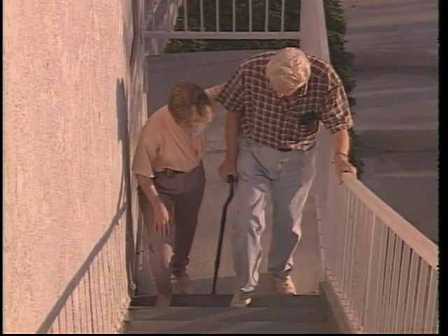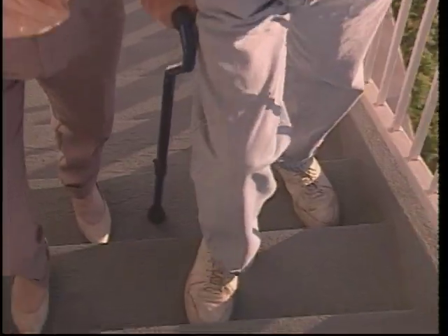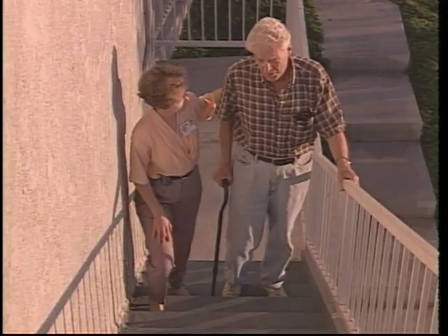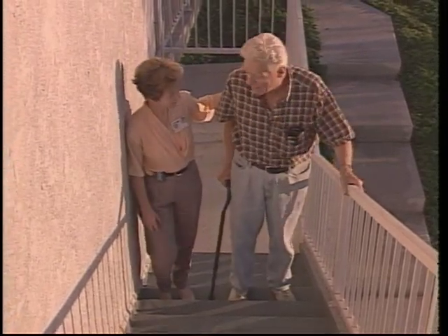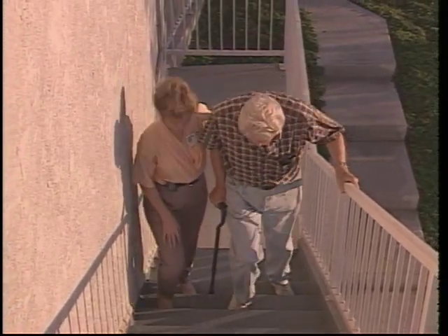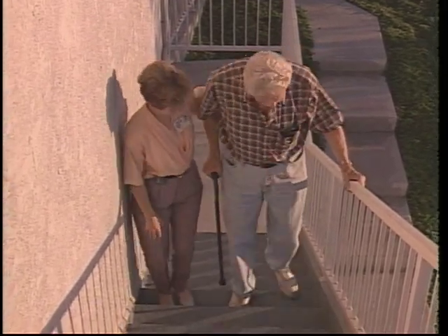Now up with your strong leg, and then allow your other leg to come up with the cane. Strong foot, then your cane. Well, sure a lot of stairs here. It's a good thing this is not a permanent injury. You're right. If it were, you'd probably have to consider moving. But for right now, let's just go one step at a time.